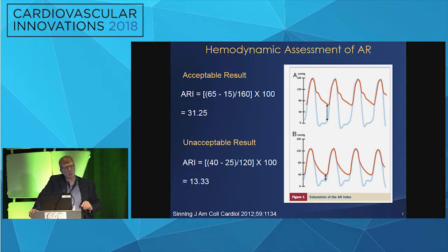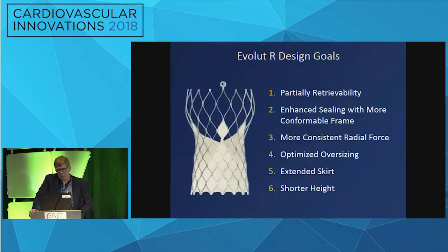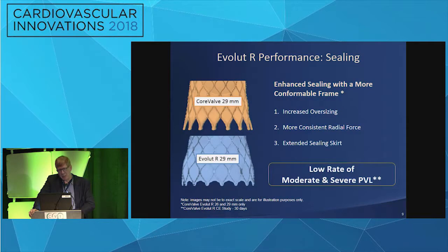Hemodynamics have been controversial about whether we should do them or shouldn't do them with the different valve technologies, and I think that they're still useful and we still do them on a routine basis, because one needs to understand how much blood is regurgitating from the aorta back down to the ventricle. Sometimes the echo doesn't give you a precise evaluation, and certainly aortography leaves much to be desired. So technique was important, sizing was important, but we had to come up with better designs.